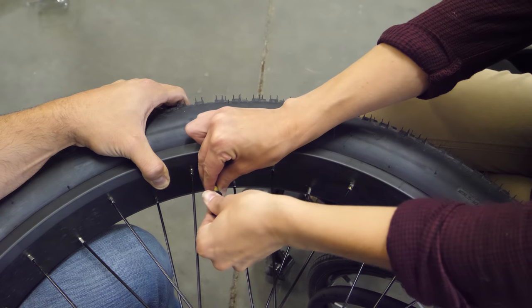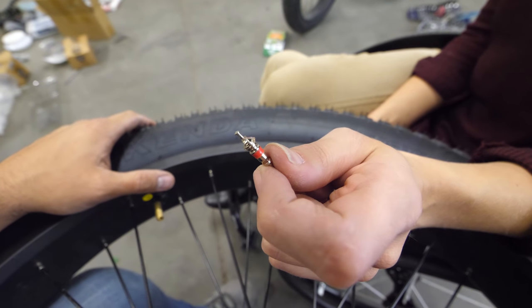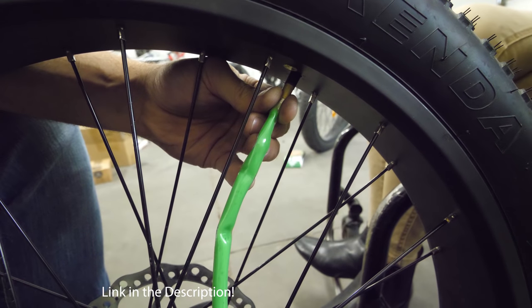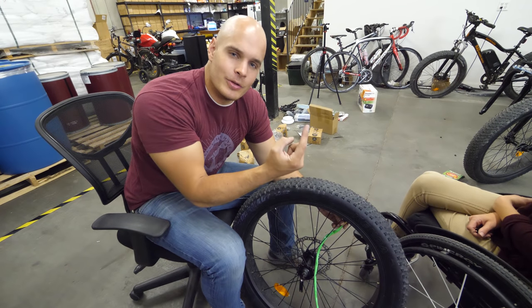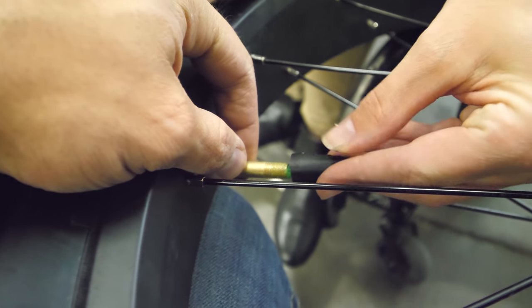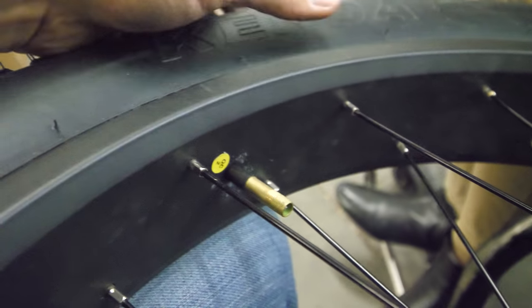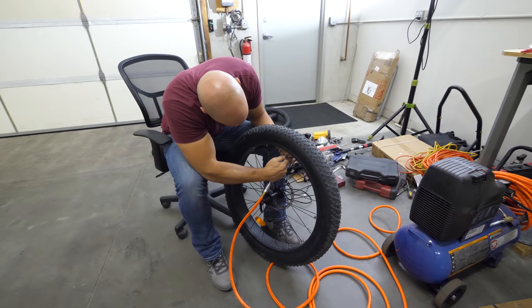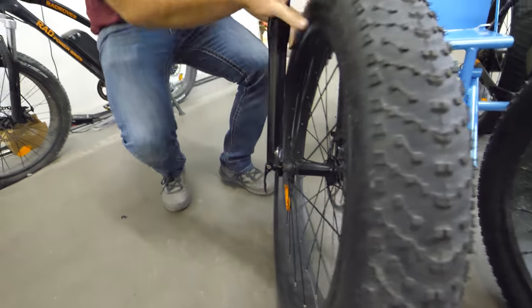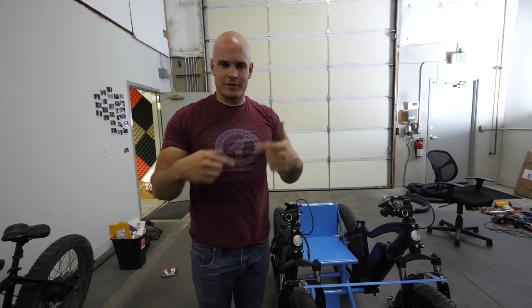I'm taking the valve stem out — it keeps the air in the tire. We're taking it out to put some slime in. Slime is interesting because it stays liquid all the time and is just going to be a puddle of slime inside your tire. If your tire ever does get punctured, the slime fills the little puncture hole and plugs it so the air doesn't escape. The valve stem is back in place. The slime is inside the inner tube right now, and we're just going to coat the inside of the tube with it. Now we can fill the tire up with air and put it back on.